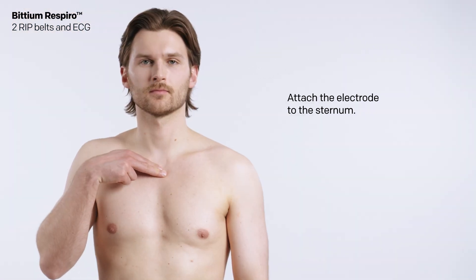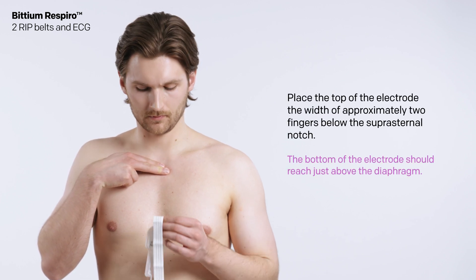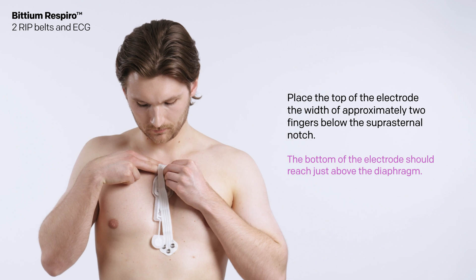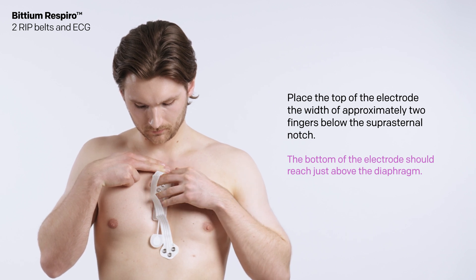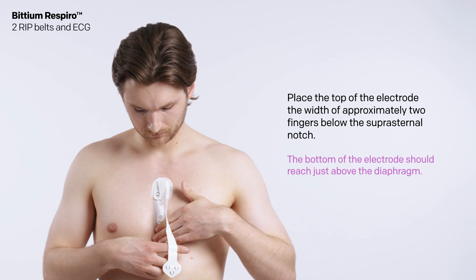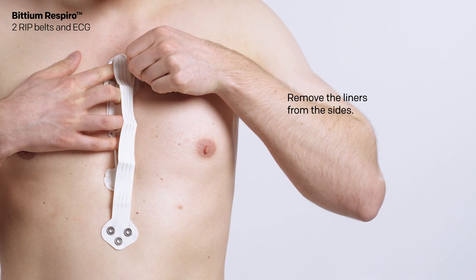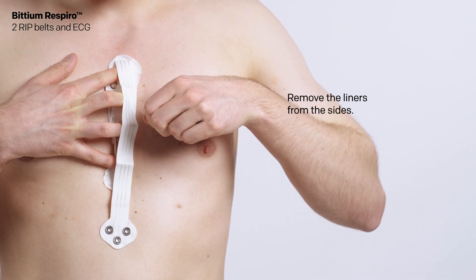Attach the electrode to the sternum. Place the top of the electrode the width of approximately two fingers below the suprasternal notch. The bottom of the electrode should reach just above the diaphragm. When the electrode is properly attached, remove the liners from the sides.